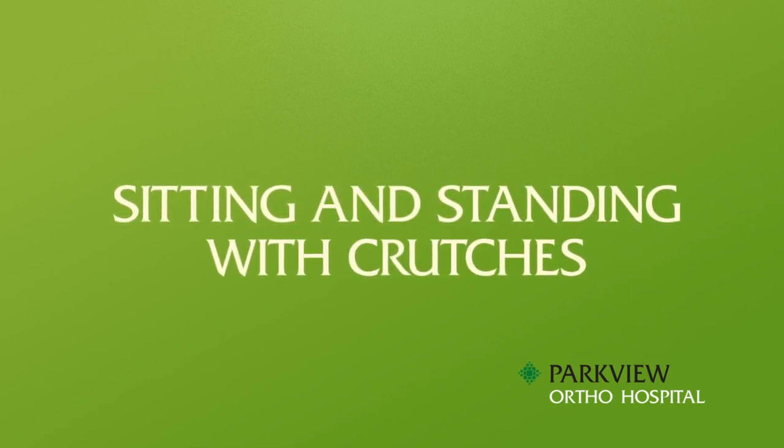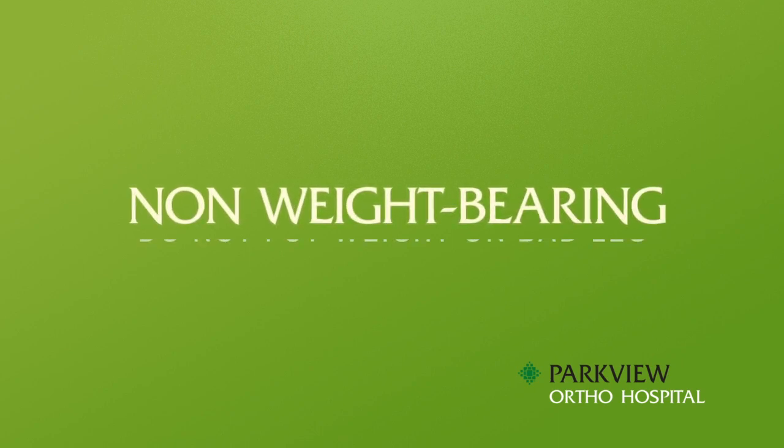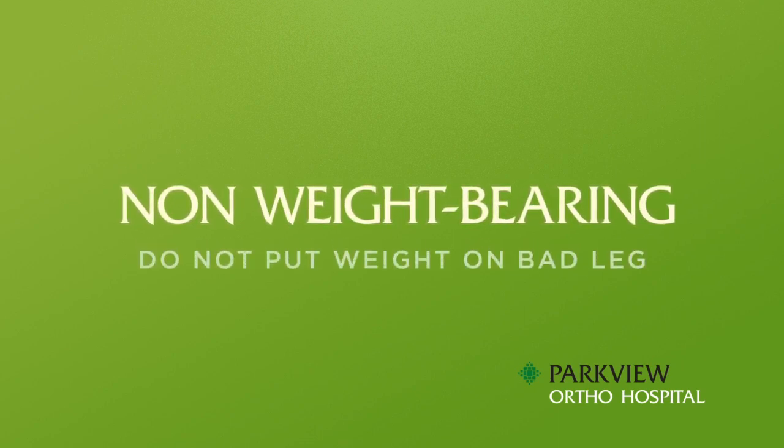Sitting and standing with crutches — non-weight bearing. Do not put any weight on your bad leg, and your bad foot must not touch the ground while walking.